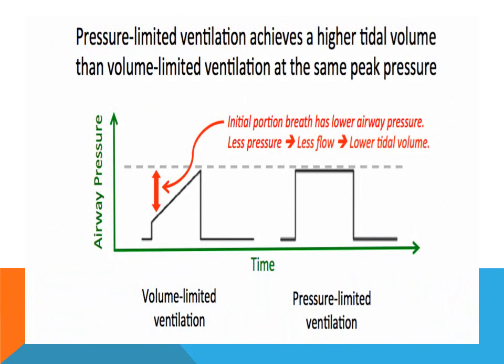Non-invasive ventilation is described as BiPAP, and BiPAP is actually the trade name. As the name suggests, it provides differing airway pressure depending on inspiration and expiration. The inspiratory positive airway pressure, IPAP, is higher than the expiratory positive airway pressure, EPAP, and therefore ventilation is provided mainly by IPAP.